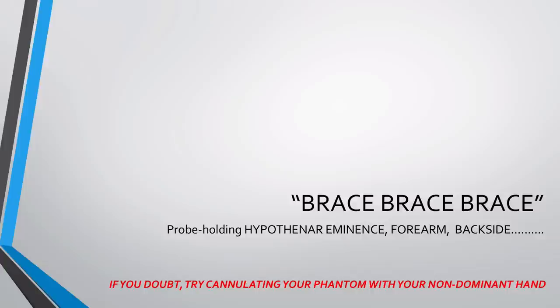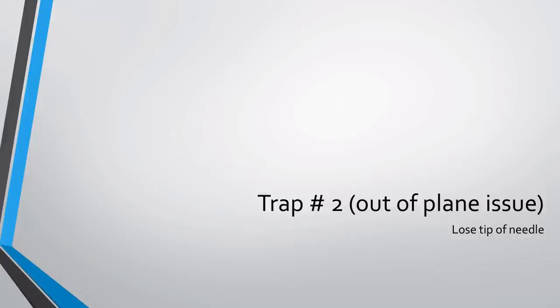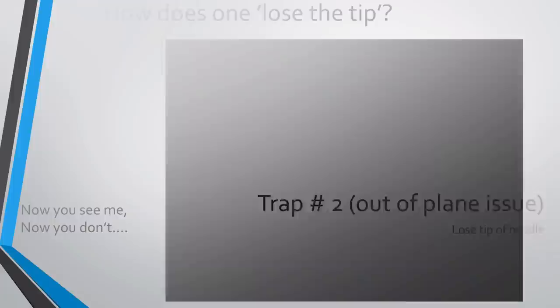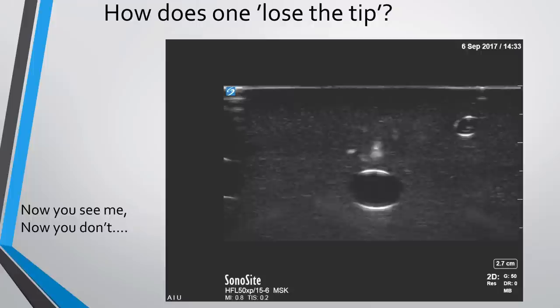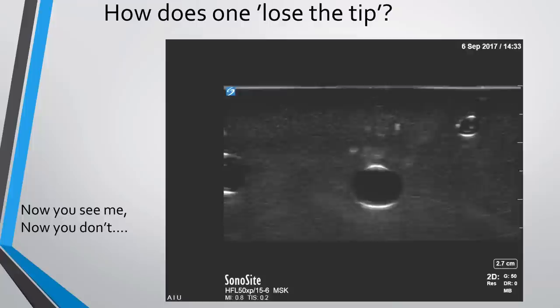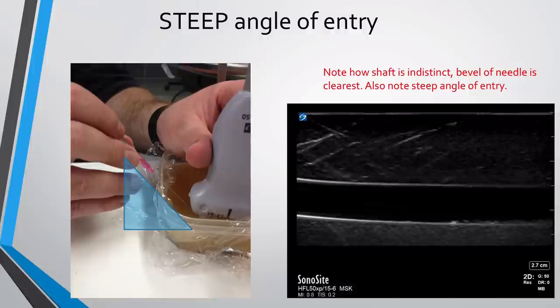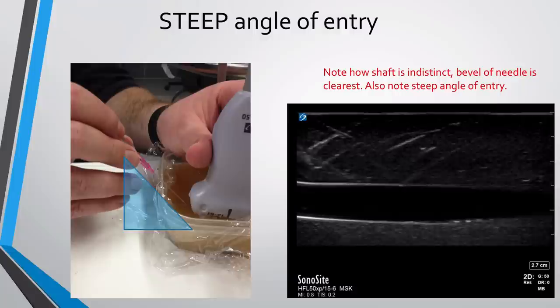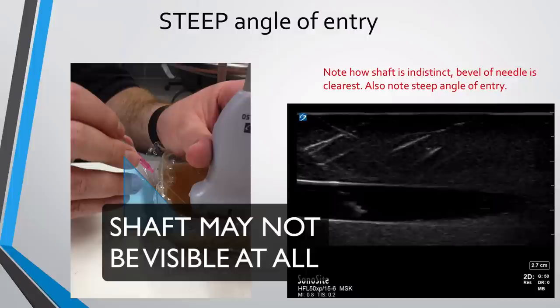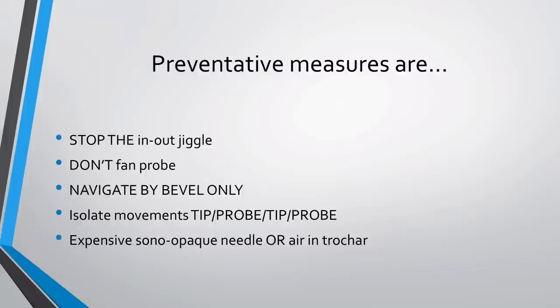Trap number two happens when you lose contact with the tip of the needle. Maybe you had to glance away briefly from the screen, or perhaps you've been using that in-out jiggle, so you start pushing in and out even more to try and find it again. Here we see the flare of the bevel and then it disappears, so you poke around a bit more, push in a bit further, then in desperation fan the probe — and lo and behold, you've hit the bed. Note how the bevel is much brighter than the shaft, particularly when you have such a steep angle of incidence. Ways to avoid this: stop the in-out jiggle, and don't fan the probe because you can lose your orientation with the vessel and the needle.